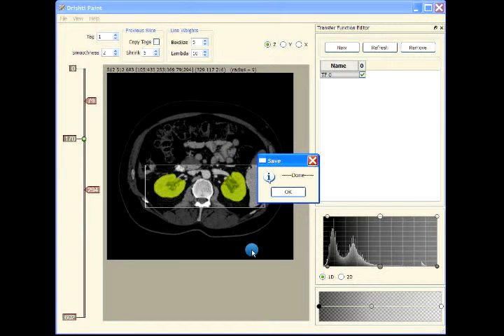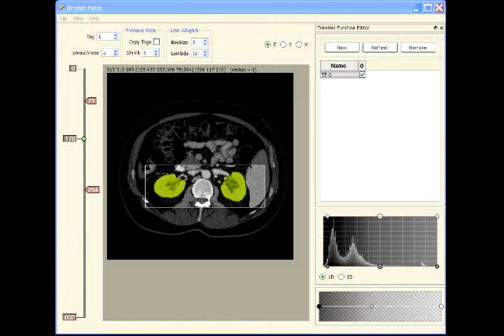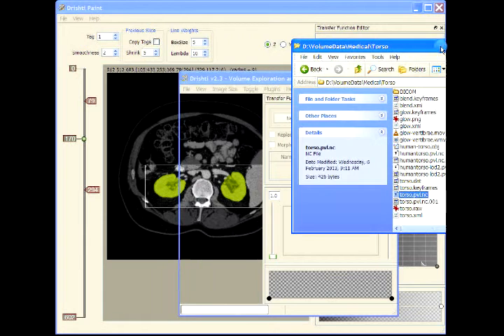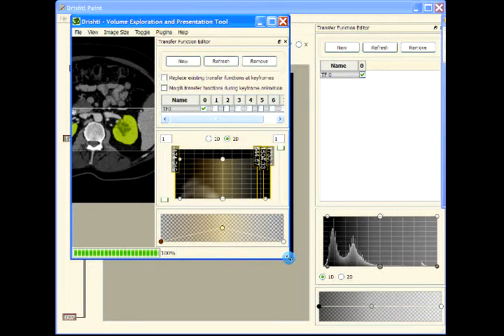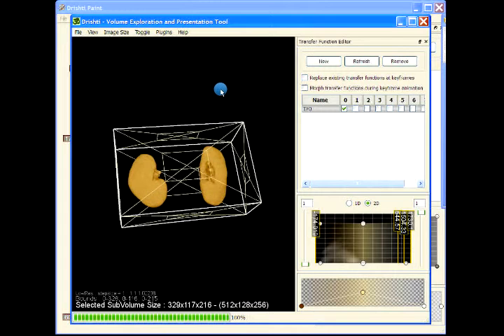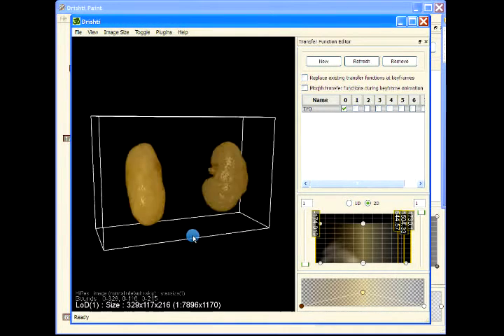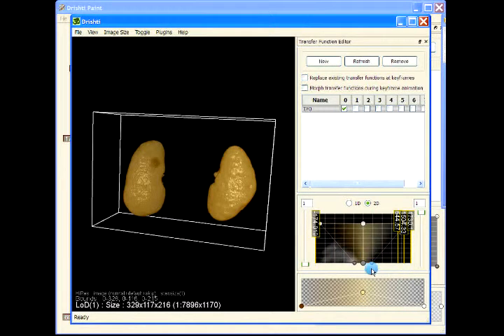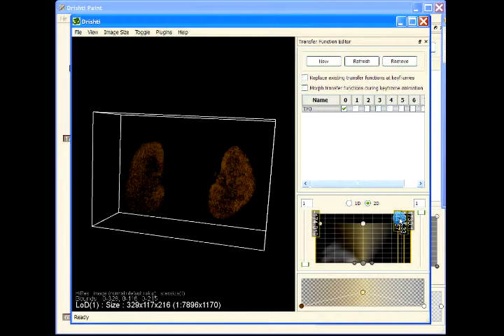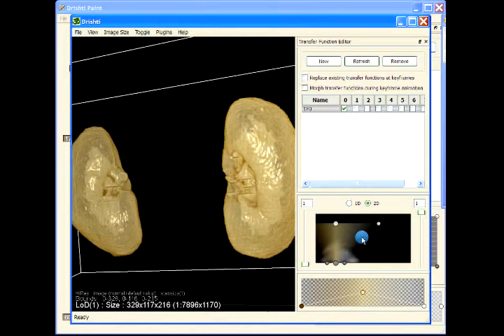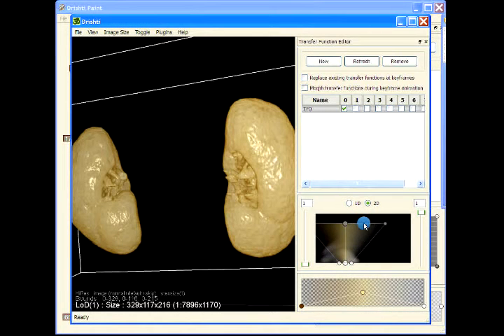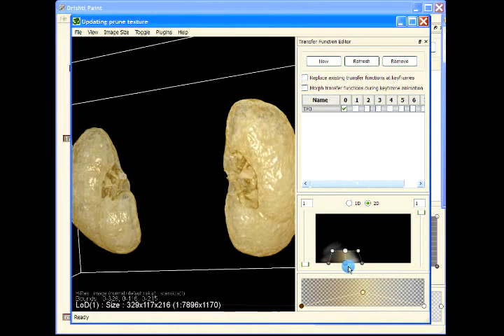Save as kidneys. Done. Now let us run Drishti and see how our kidneys look. Load kidney.pvl.nc — these are the kidneys that we saved. This information is copied from the original data file, which is the pvl.nc. You can save data from the pvl.nc file or you can just save the tags to view in Drishti.